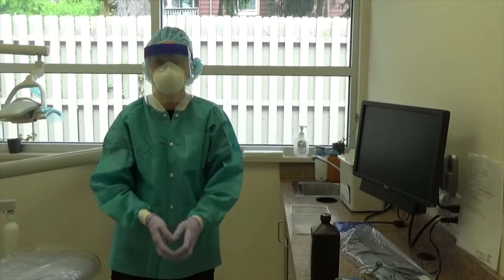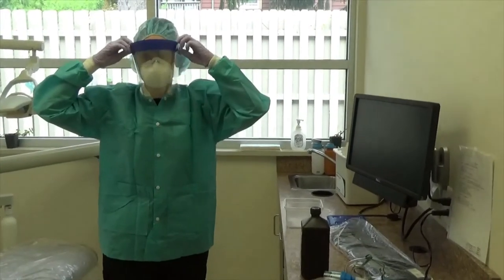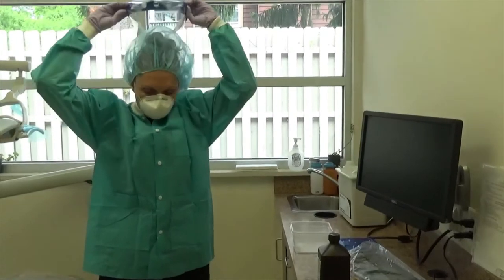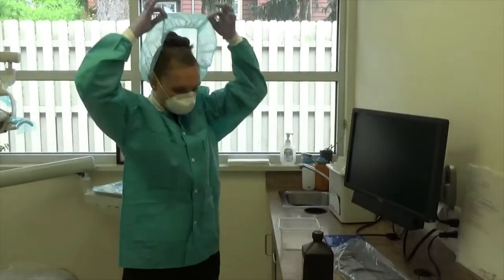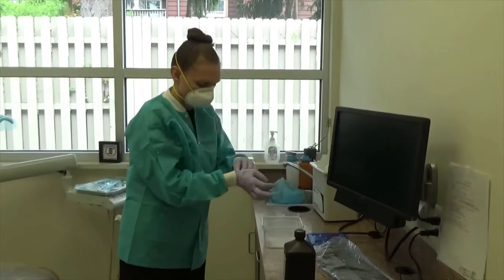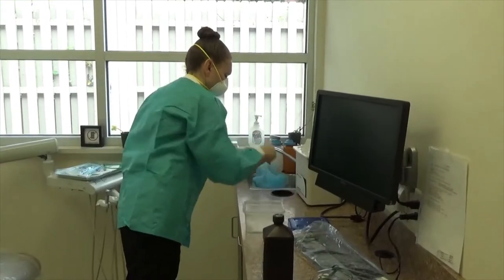Now we're going to talk about when you're going to be going to lunch and at the end of the day. You're going to use the peroxide nebulization or the ozone. You're going to remove your face shield and your head covering. You're going to take your gloves off because they have now been contaminated because you've touched something that has already been covered with aerosol.